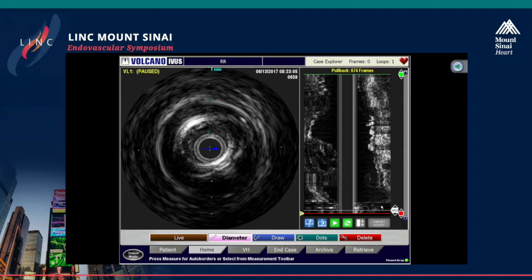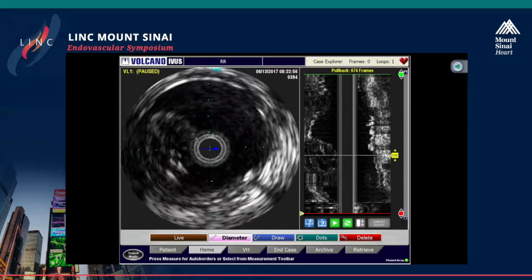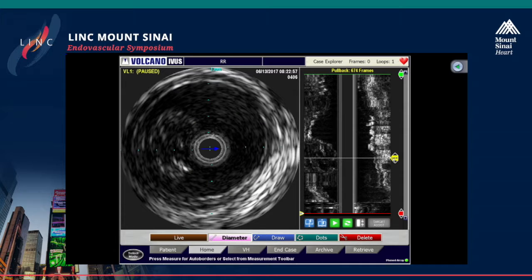So we felt that the controversy here was really to discuss the endovascular approach of common femoral artery disease here versus how the panel would manage it, and we can explain our rationale to why we are going to go ahead and do endovascular.